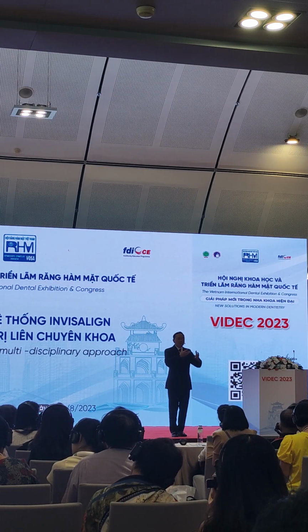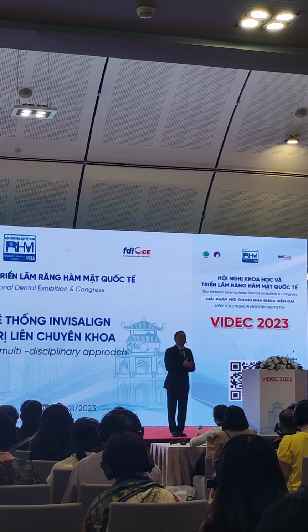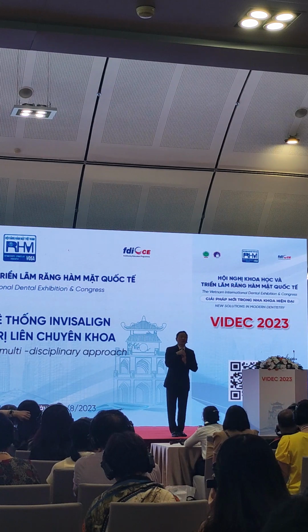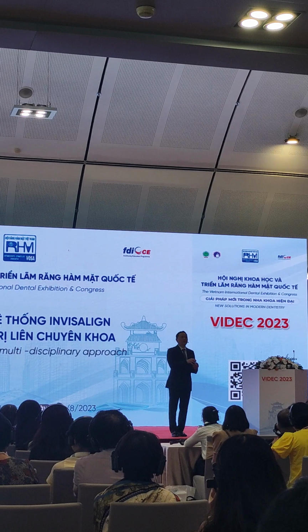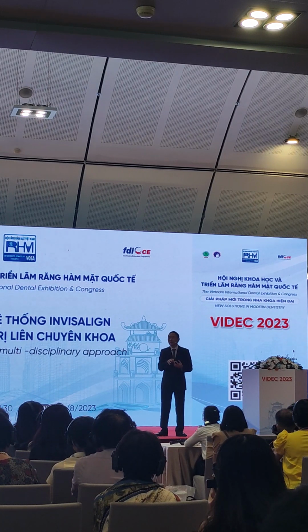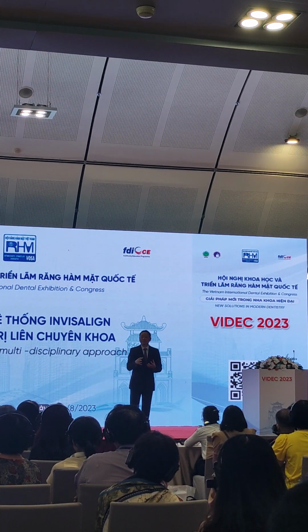And then, because the patient is wearing the Vivera retainer every day, I will just stop at the point that I deliver the Vivera. Usually I want the patient to have the incisors free from contact at CO. And of course, if good, I want canine protection. But most of the time, immediately after my tooth movement and use of the retainer, it may not be the best occlusion. But after the patient wears the aligner for 9 months to 12 months, I reduce the wearing time.